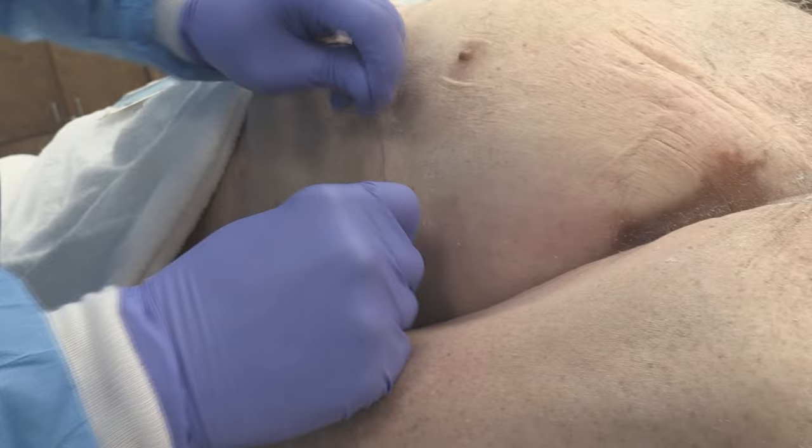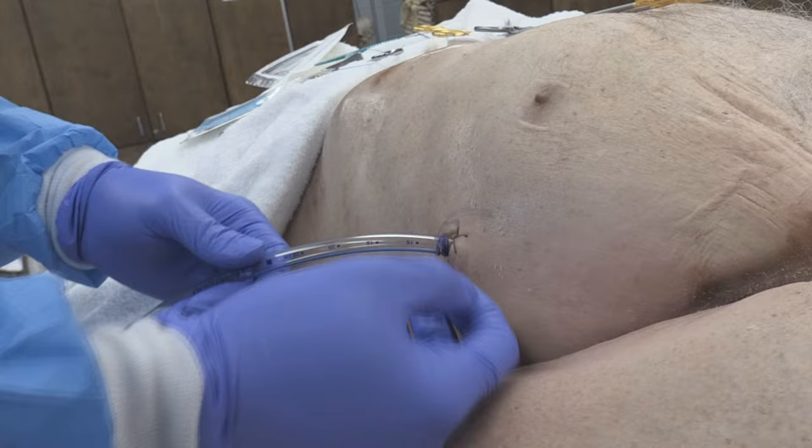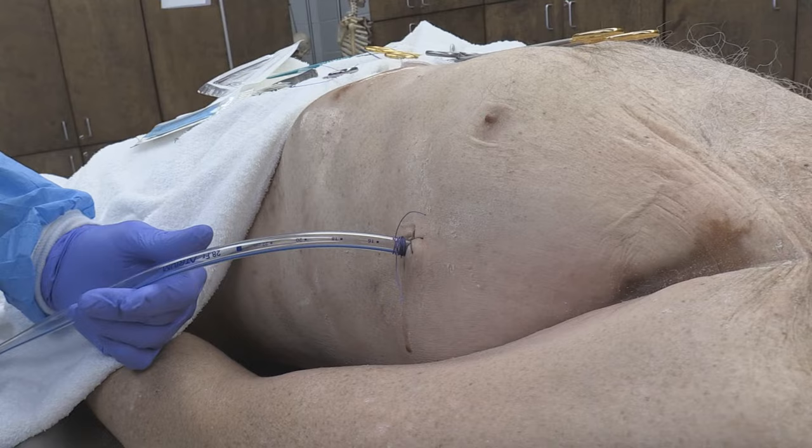What's the name — Soweto tie? The Soweto tie comes from Soweto, the murder capital of the world. That's where I trained and I did a lot of work over there. The Department of Surgery uses this particular tie on all their patients that require chest tubes.